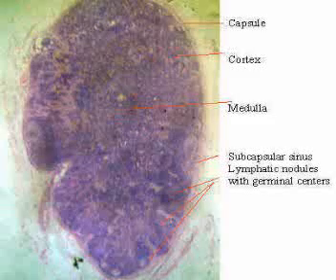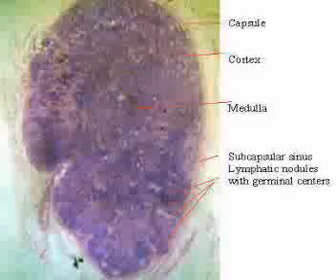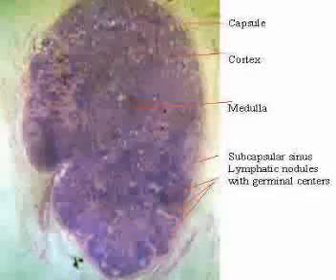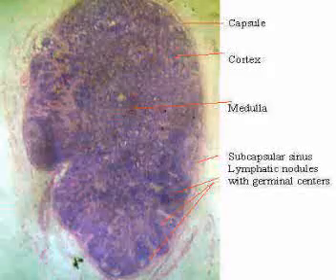Differential diagnosis. Lymph nodes can be confused easily with the spleen, thymus, and tonsil. All are lymphatic organs and they have lymphocytes in abundance. Examine their features which aid their recognition.